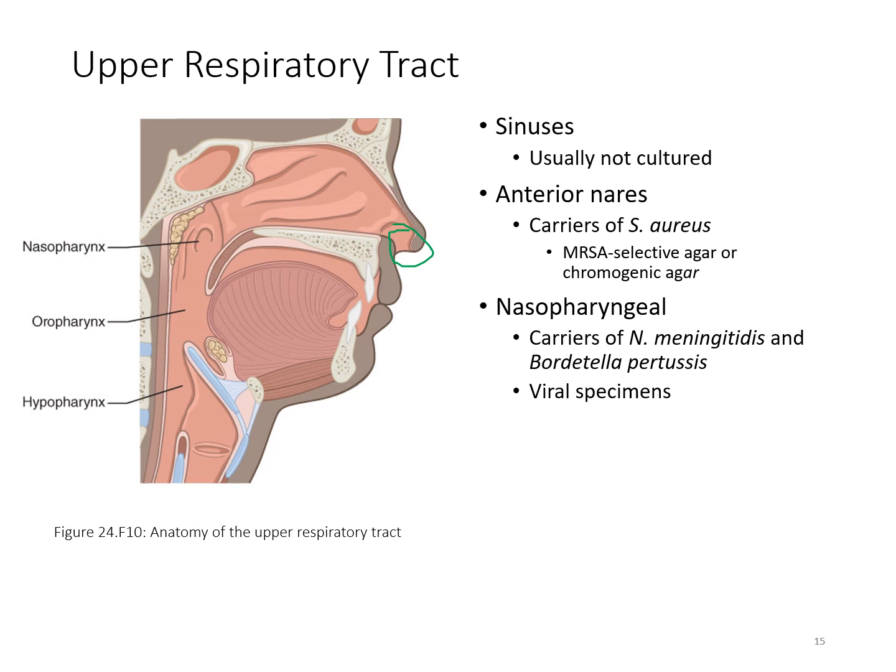Your nasopharyngeal sample is going to go up through the nose, along the base of the nose, and all the way back to the nasopharyngeal area to get that actual collection. This is where they go for your flu swabs and things like that. Viral specimens are going to get a nasopharyngeal.